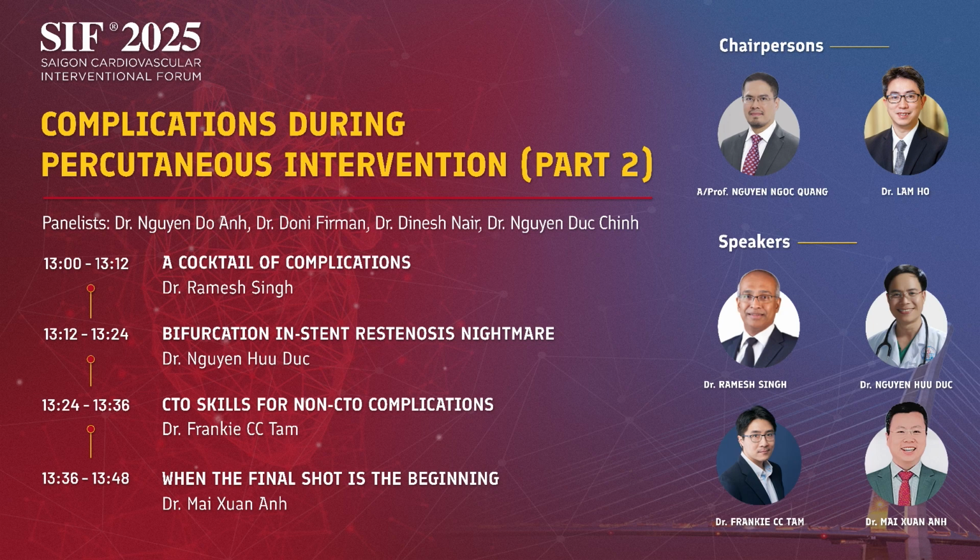I think this is a super challenging case. During the shot, you did not see any flow in the circumflex, and then you can perform the retrograde wiring. Yeah, so we used the angiogram at the beginning as a roadmap. Wow. And by feeling, yeah.